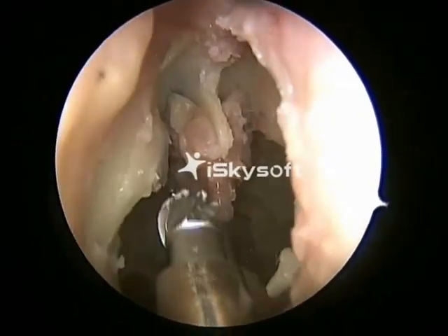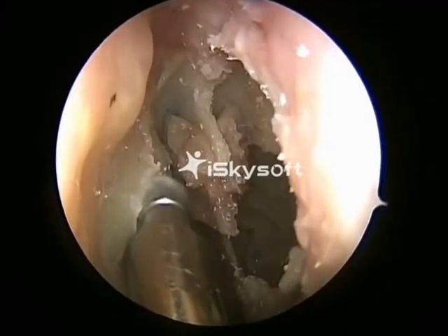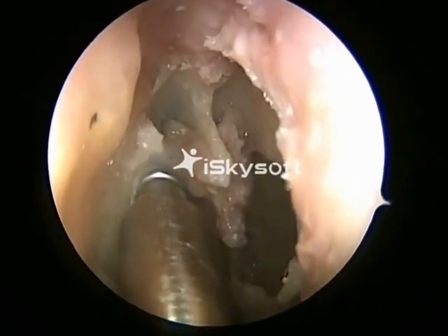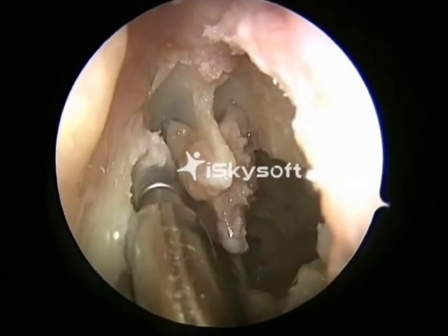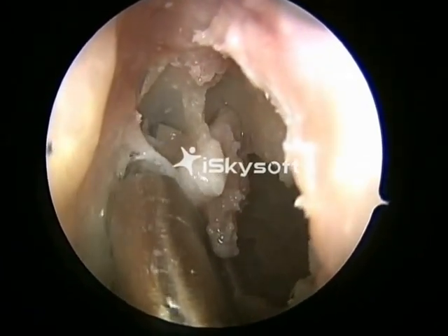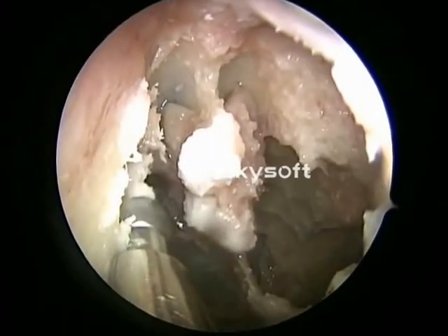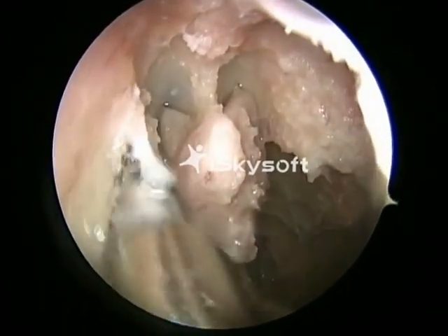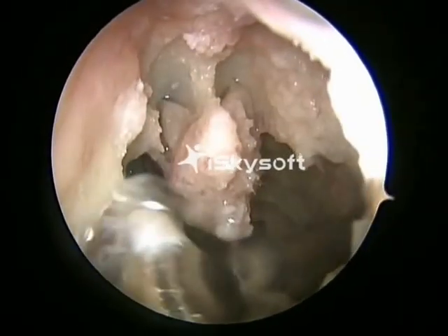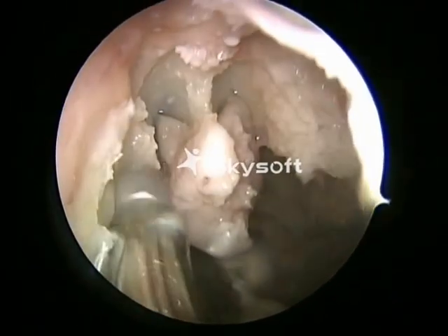We then start drilling the frontal process of the maxillary bone. Drilling is done using a 4 mm cutting burr, and drilling is done anteriorly and laterally. It should never be done medially because this will lead to entry into the skull base. We should always do it anteriorly and laterally.